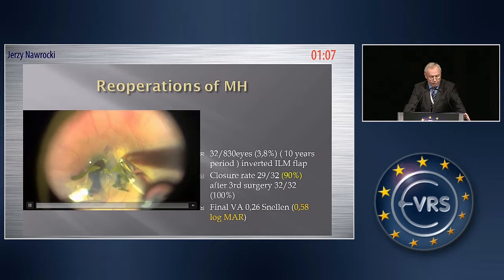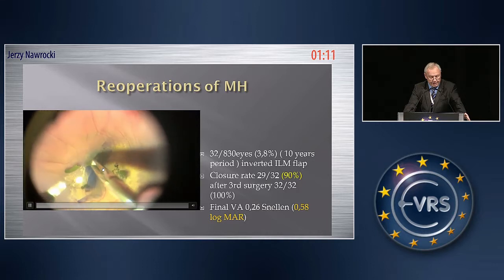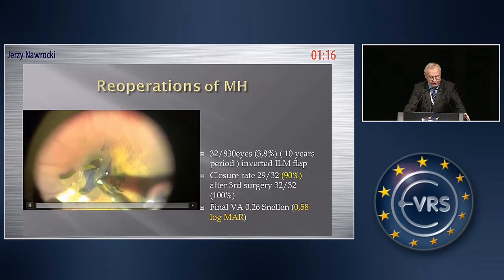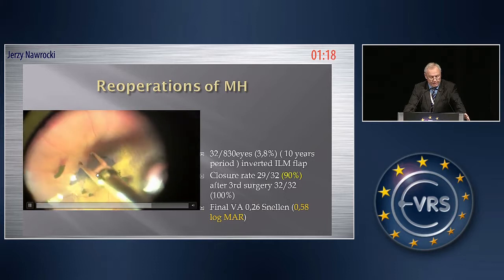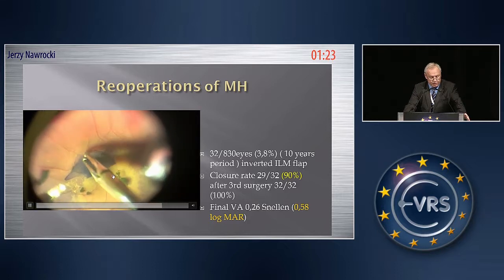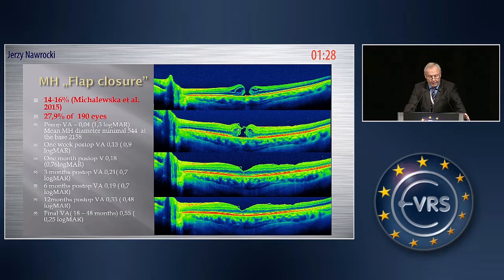Here you see almost complete filling with silicone oil, but the flap moved once again away from the macular hole. And in these cases, it is relatively simple to cover it once again and secure the flap in position. If you achieve that, you have 100% closure of the macular hole. What happens with swept source OCT images in these cases? We found a new type of macular hole closure, which we call flap closure.